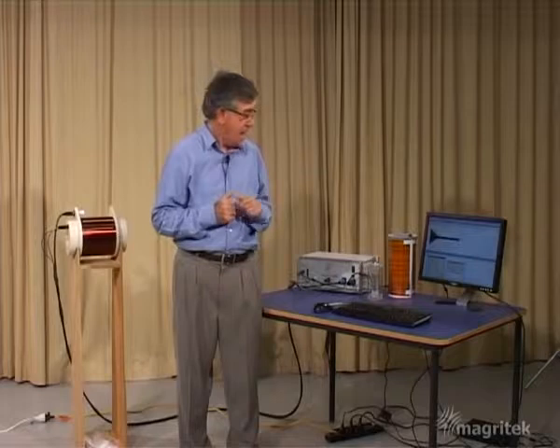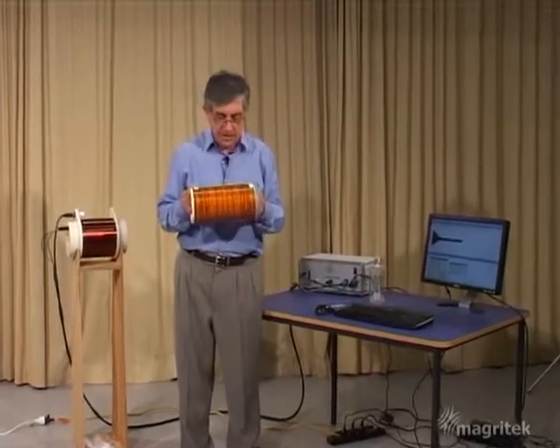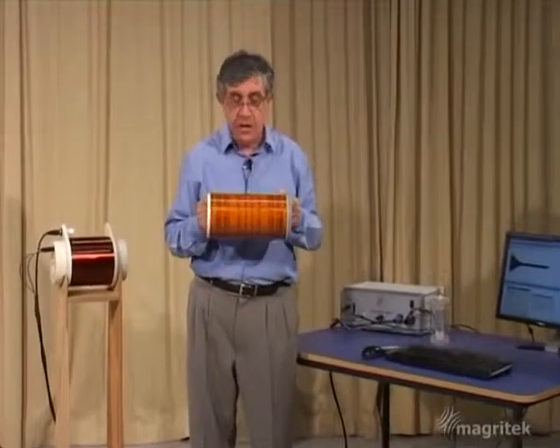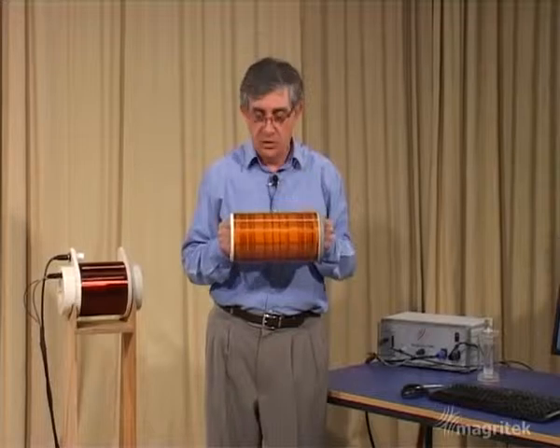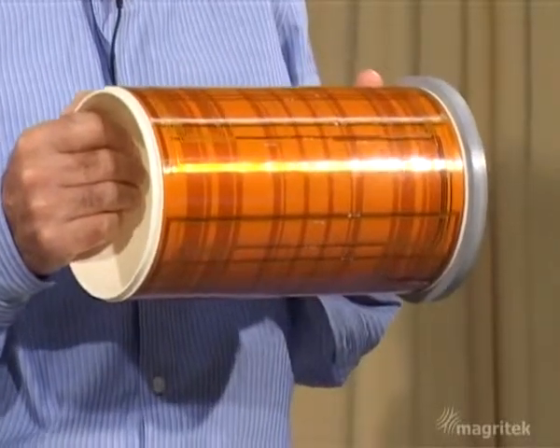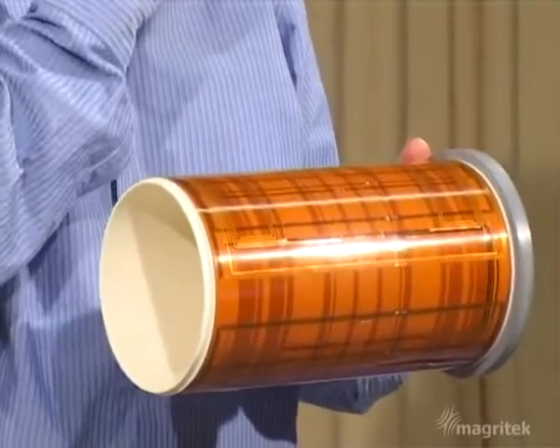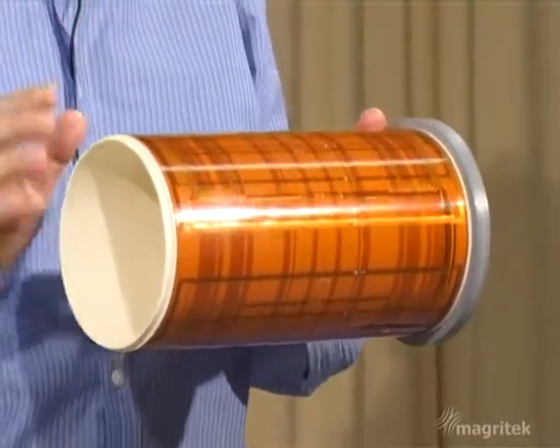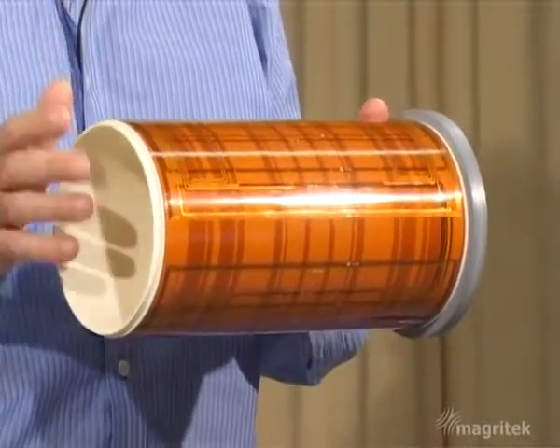Well, it turns out that we can, because inside the Terra Nova probe is this set of complicated looking coils known as magnetic field gradient coils. And what they do is to provide a magnetic field that varies linearly in three orthogonal directions, so that by putting a small amount of current in these coils, we can correct for imperfections in the Earth's magnetic field.